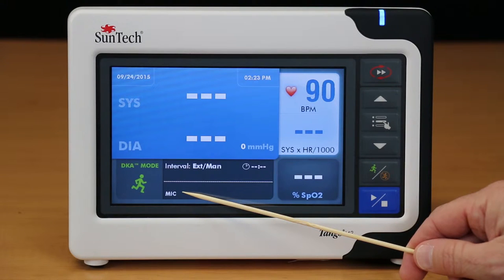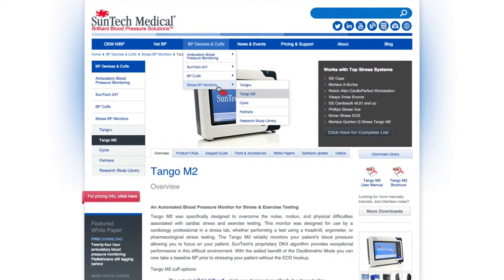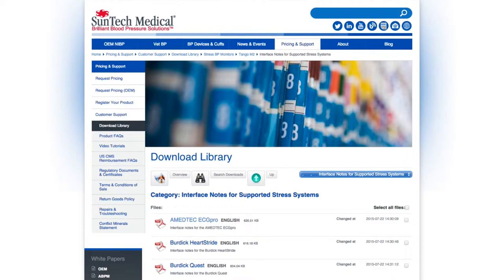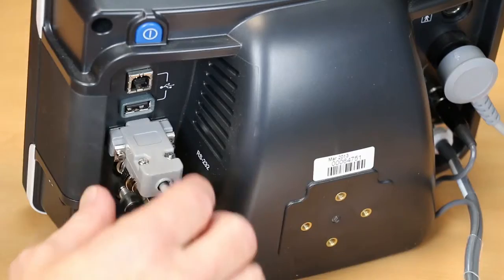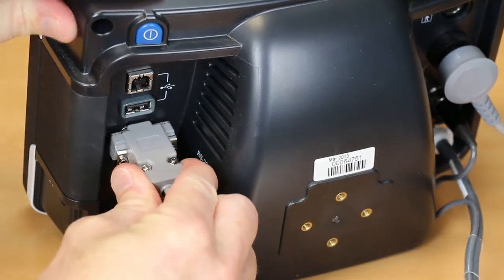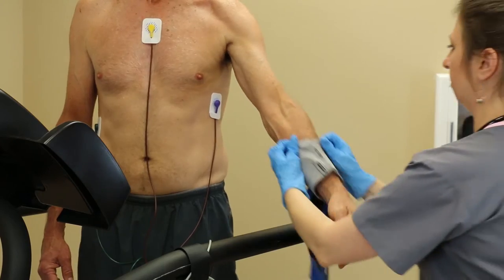If you don't see this white dot, you will need to verify that both the Tango M2 and stress system are programmed correctly. If you need help with programming, there are interface notes on the Centec website or in the Tango M2 e-library we talked about in video 4 of this series. If this still does not correct the problem, try disconnecting and then reconnecting the RS-232 cable completely.